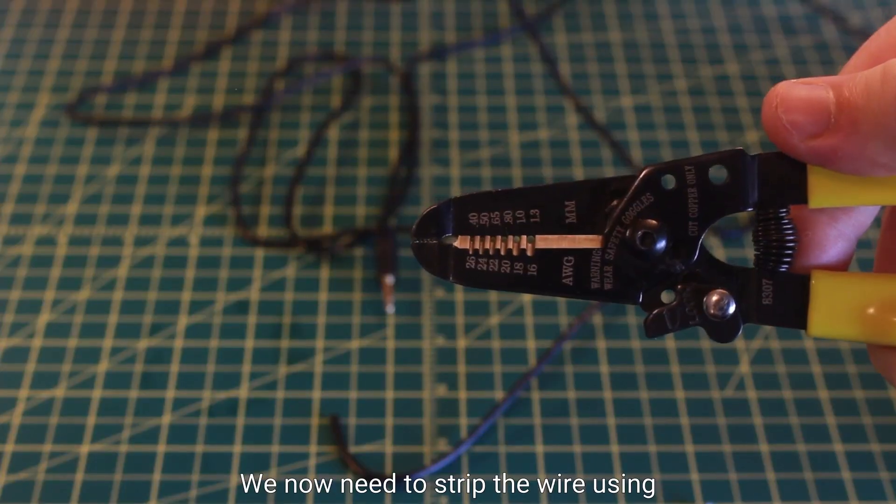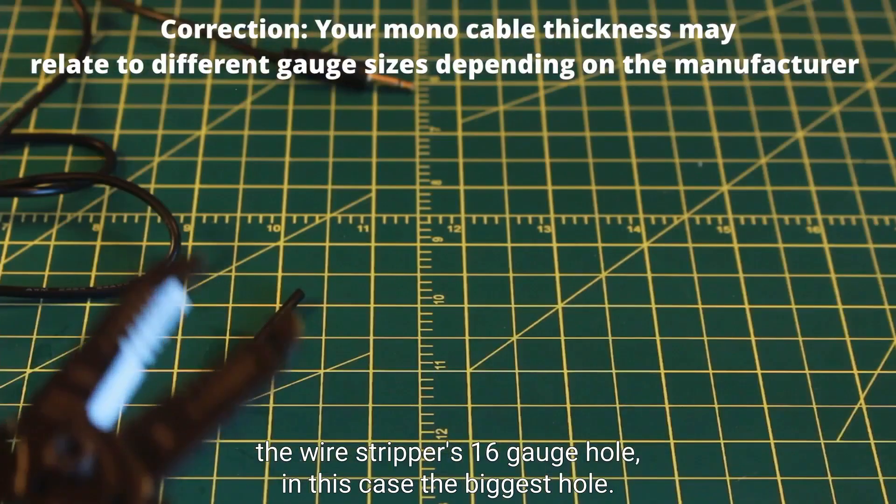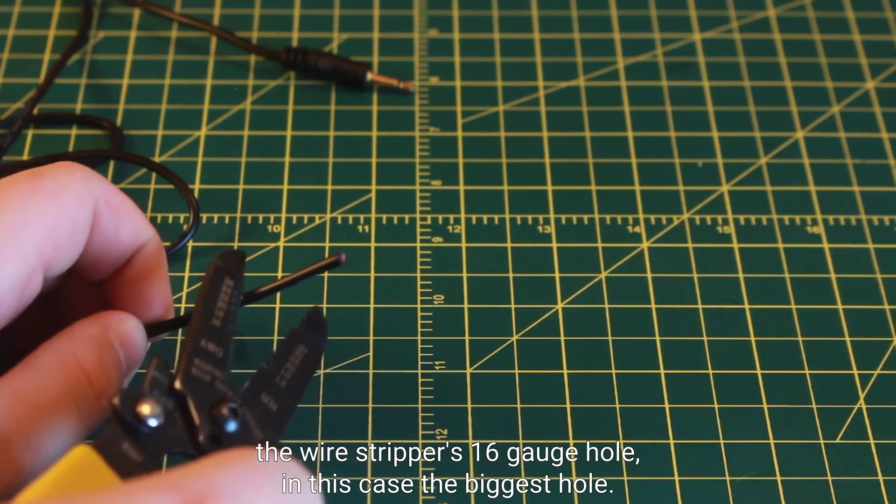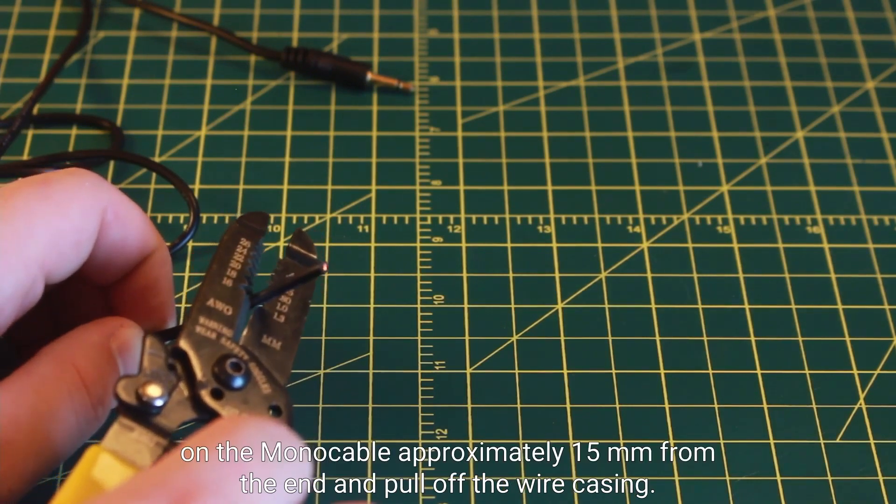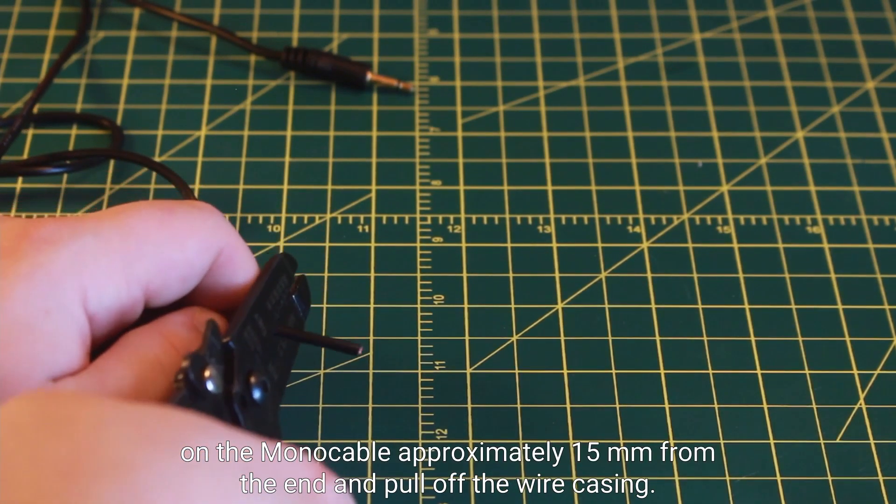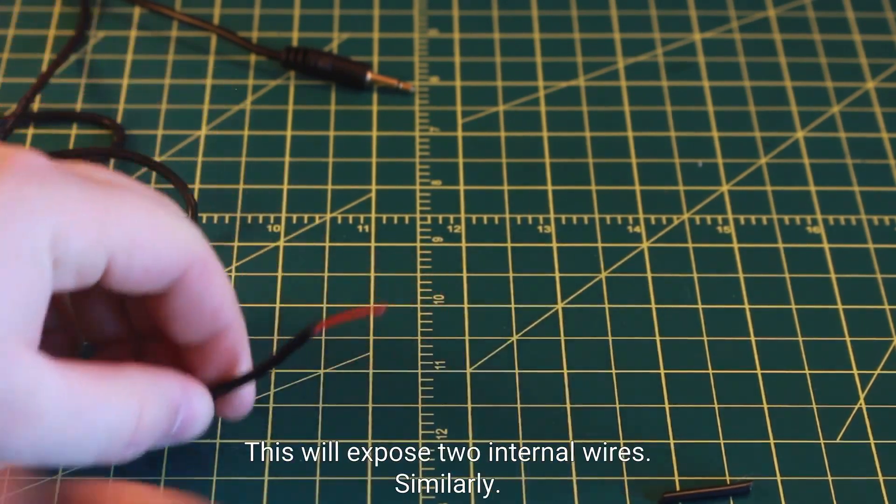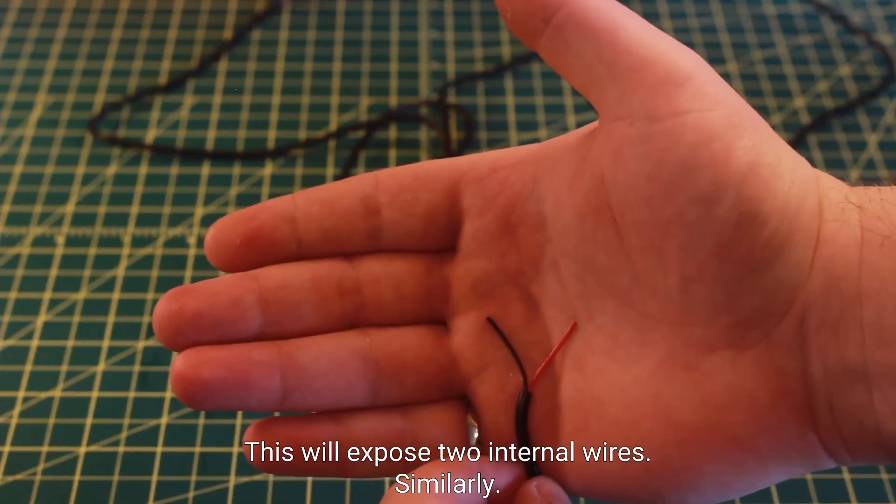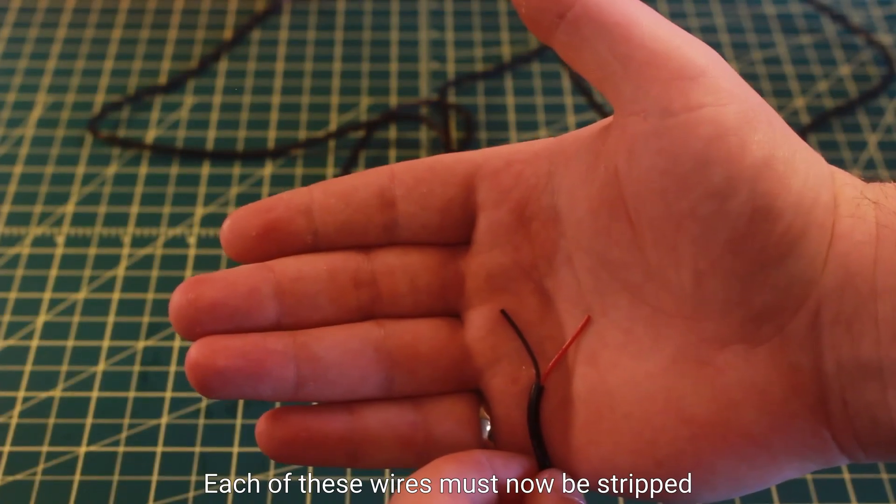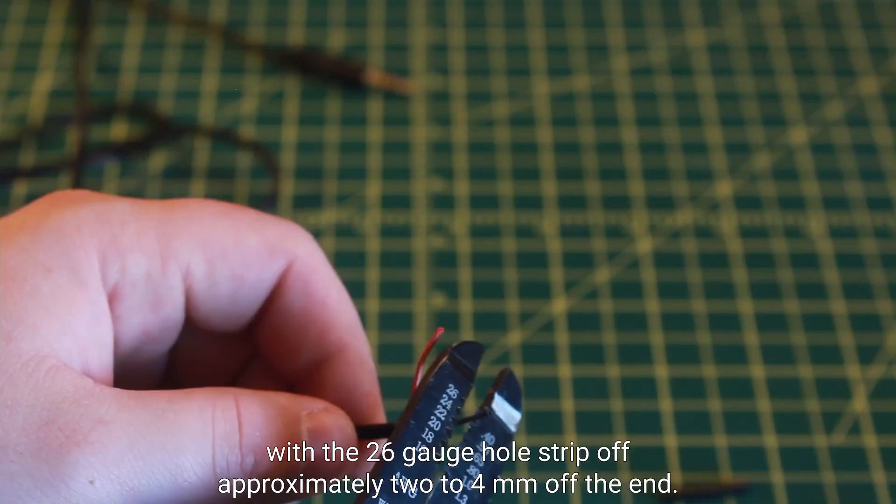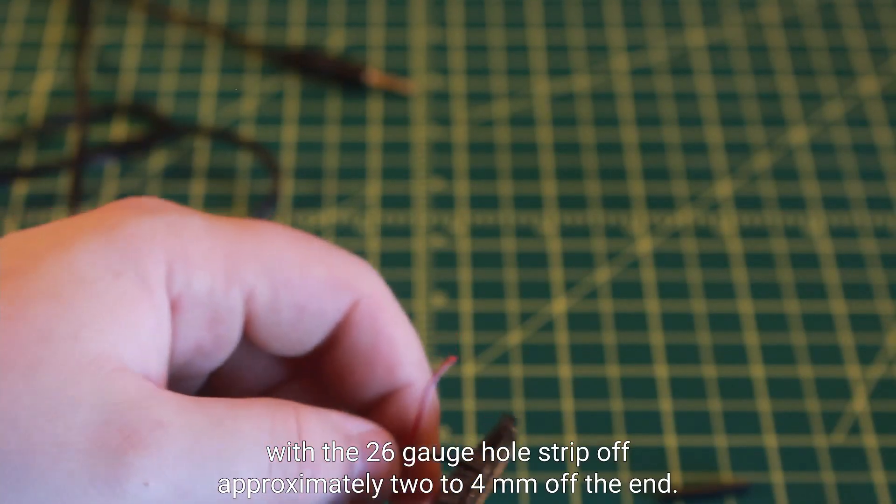We now need to strip the wire using the wire strippers 16 gauge hole, in this case the biggest hole. Gently squeeze the wire strippers on the mono cable approximately 15 millimeters from the end and pull off the wire casing. This will expose two internal wires. Similarly, each of these wires must now be stripped with the 26 gauge hole. Strip off approximately two to four millimeters off the end.